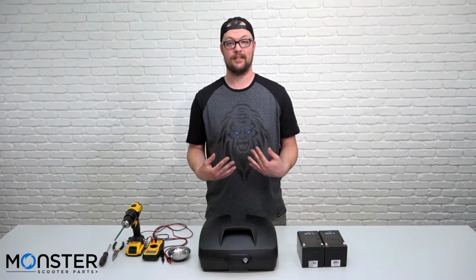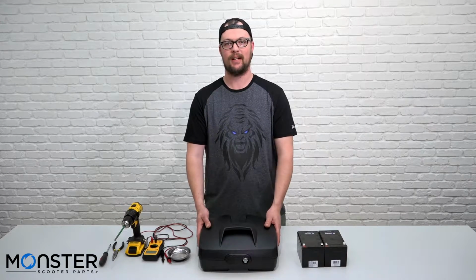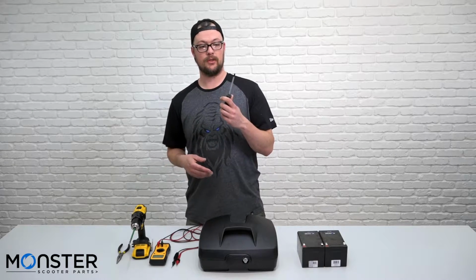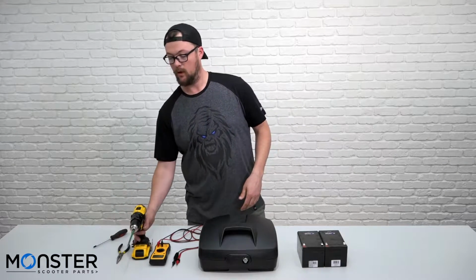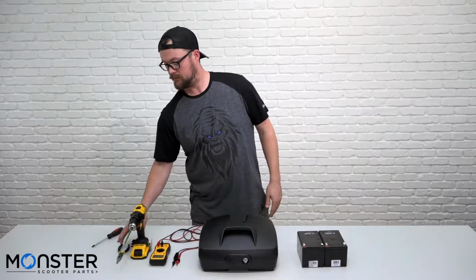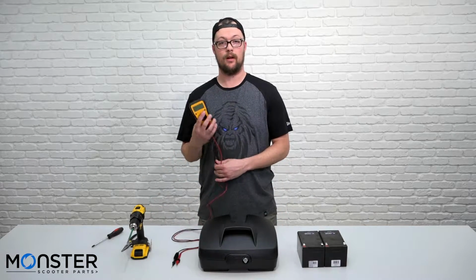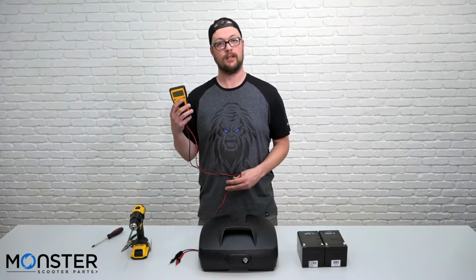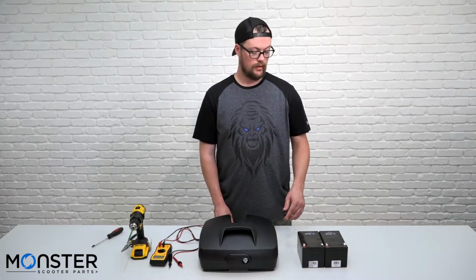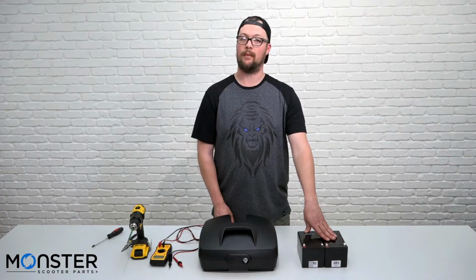Hey there, I'm Mitch, and today we're going to be replacing the batteries on our GoGo Elite standard capacity battery box. Tools that you'll need for this job are going to be a Phillips head screwdriver with a long neck, or possibly even a drill with a long Phillips head bit attached, some needle nose pliers, and if you have it, a multimeter, which you can get at most auto parts stores. You'll also definitely need your replacement batteries, which can be 12 or 15 amp hours.